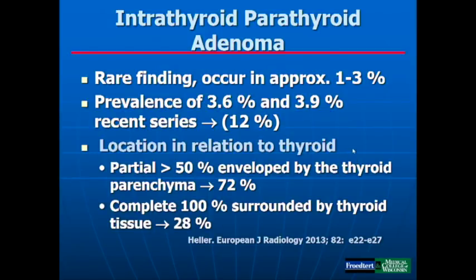Intrathyroid parathyroid adenomas are rare. A recent series located a large number of adenomas in locations in relation with the thyroid. The vast majority of this is from the University of Pittsburgh.